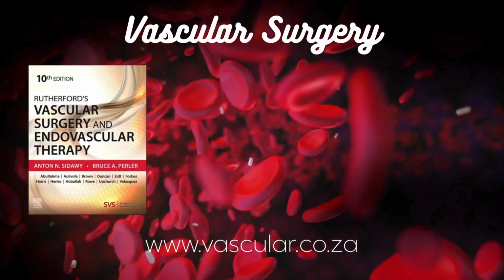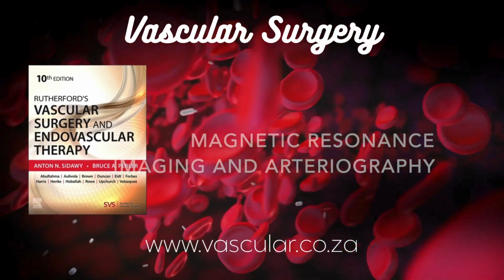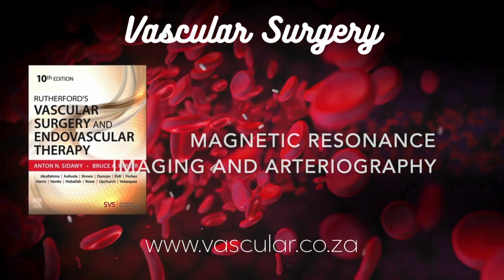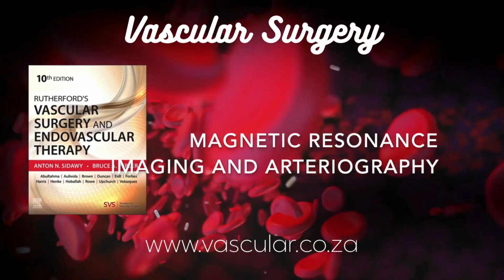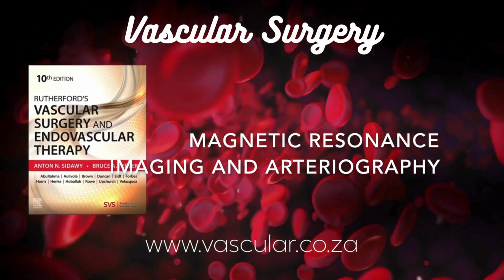That's a really good analogy, yes. And finally, this detected signal, how does it become a picture? That raw signal goes through a pretty complex mathematical process called a Fourier transform. This transform is what converts all the frequency and timing information embedded in the signal into the spatial information needed to reconstruct the final MR image that we see on the screen.